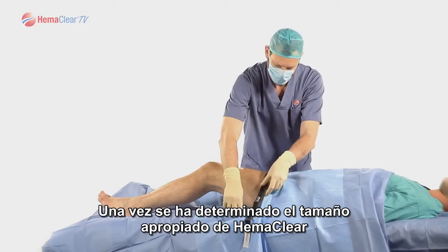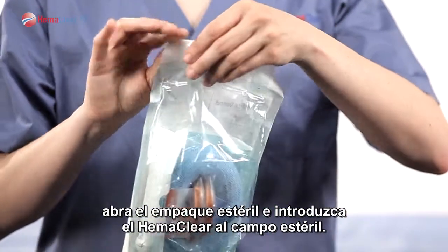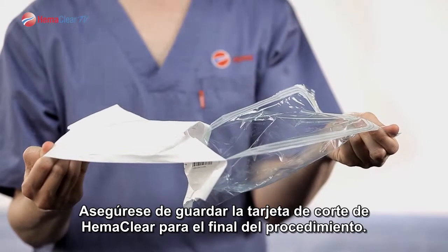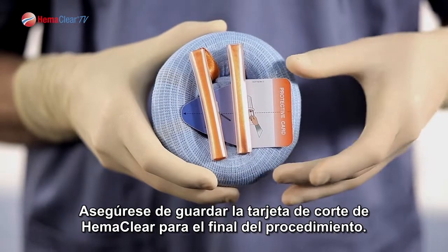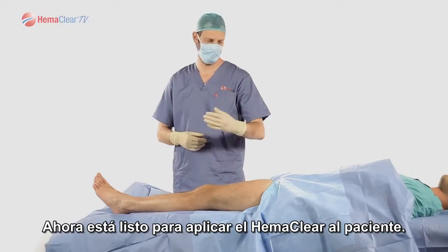Once the proper size HemaClear has been determined, open the sterile packaging, introducing HemaClear to the surgical field. Note that the packaging is dual-peel packed. Be sure to save the HemaClear cutting card for the end of the procedure. You are now ready to apply the HemaClear onto the patient.